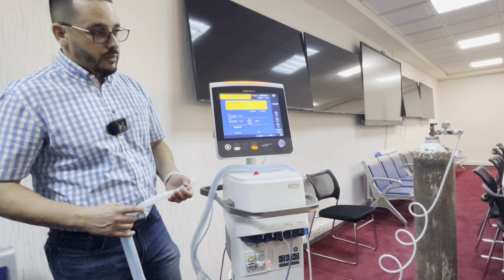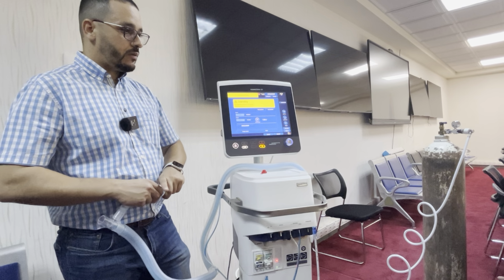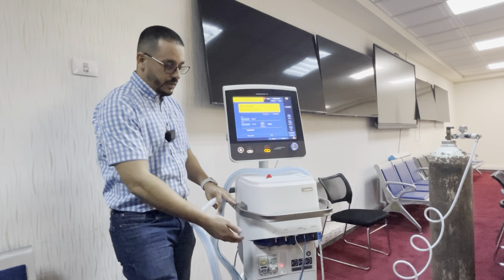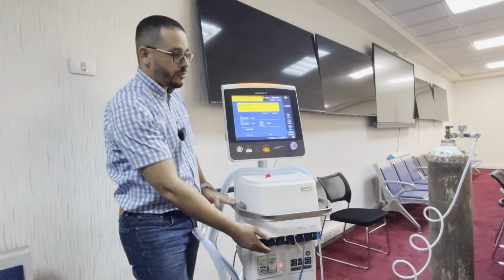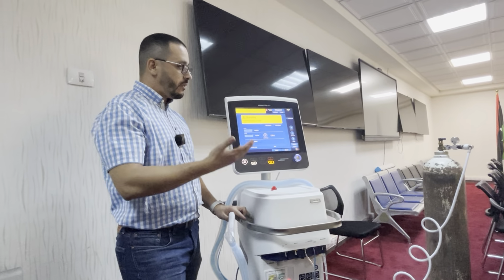Regarding the filter, which is the proper place to use it? Sometimes they use it on the expiratory valve, sometimes here. Normally we should use two filters. One on the inspiration side, to protect the patient, because the gas source is sometimes contaminated, and sometimes not even contaminated.